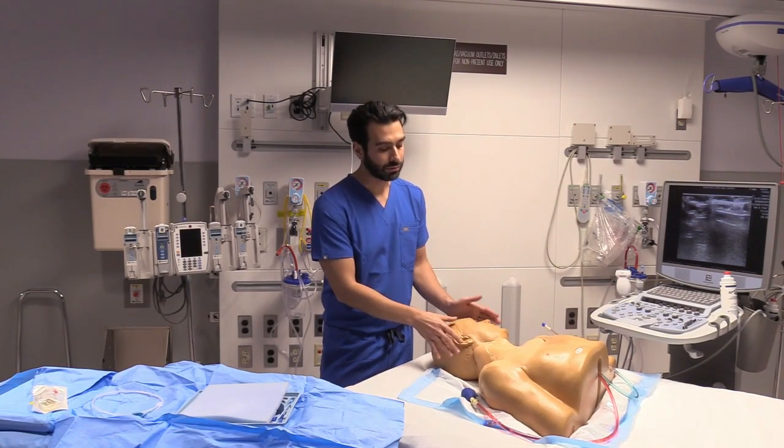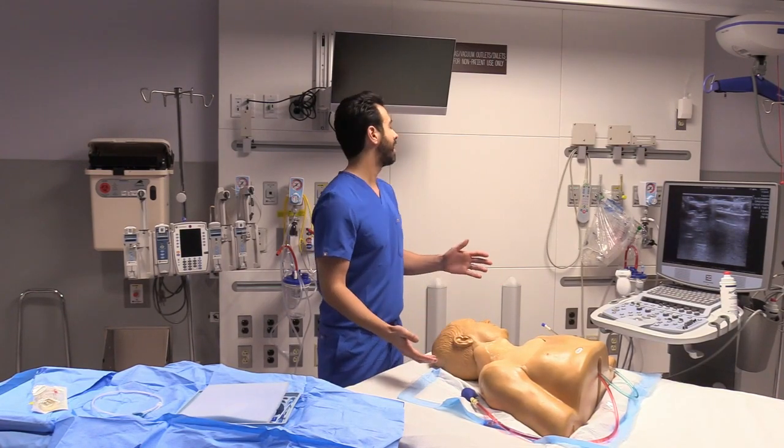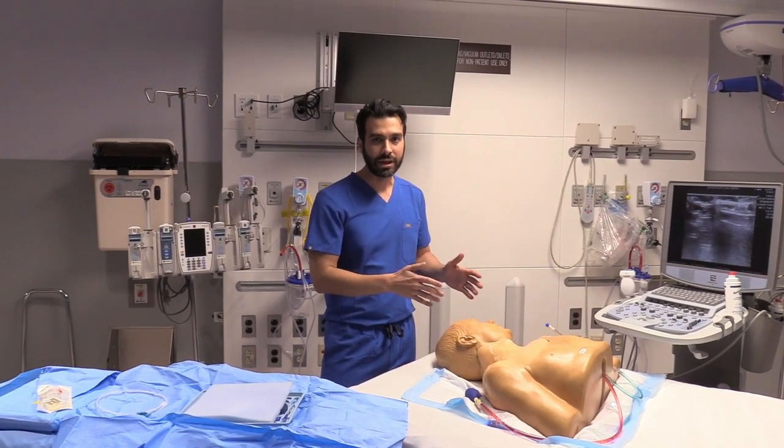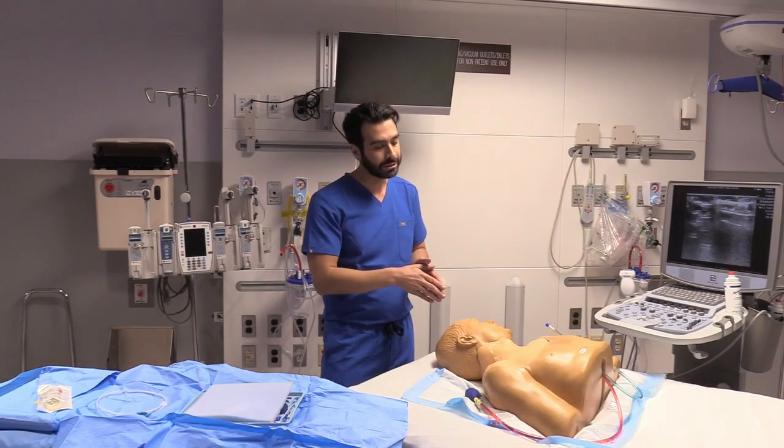A slight head turn will just give you enough room to be able to place the catheter itself. So I don't usually have them try to turn so their whole body is facing the opposite direction. I think a slight turn is more advantageous in keeping the carotid and the IJ lateral to each other.